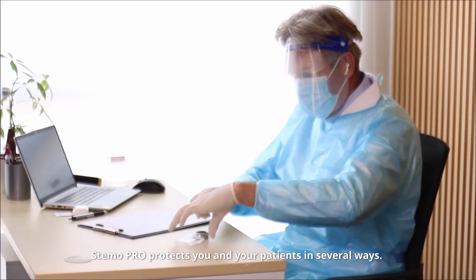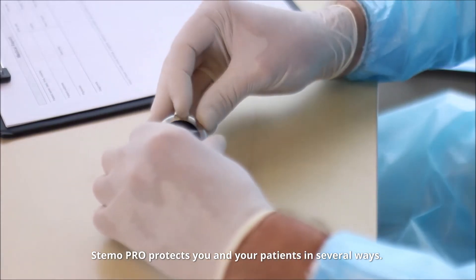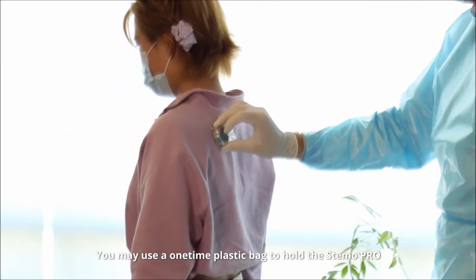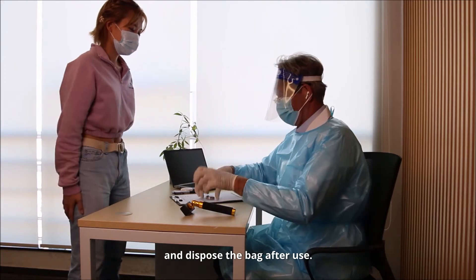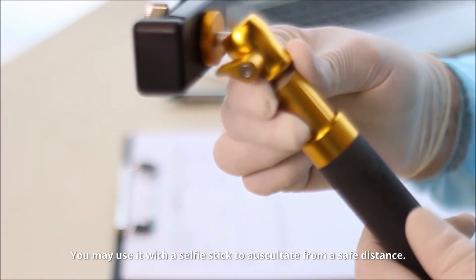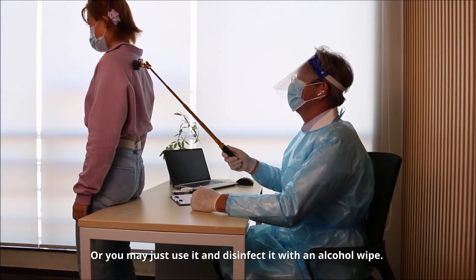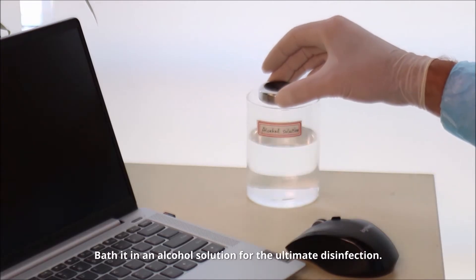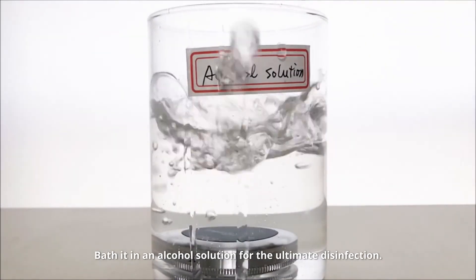Stemo Pro protects you and your patients in several ways. You may use a one-time plastic bag to hold the Stemo Pro and dispose the bag after use. You may use it with a selfie stick to auscultate from a safe distance, or you may just use it and disinfect it with an alcohol wipe. Bathe it in an alcohol solution for the ultimate disinfection.